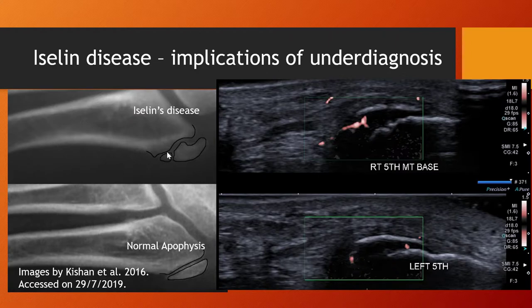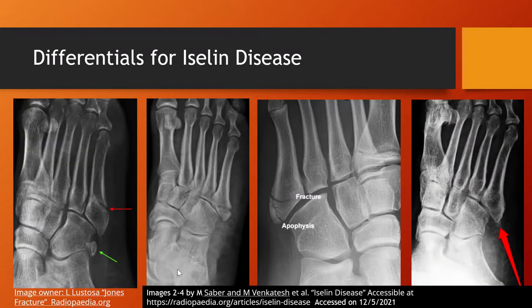And potentially, some of these growth plates don't fuse because of the constant traction and the lack of rest. So of note here, the apophysis is parallel with the shaft of the metatarsal. So the orientation of that bony cartilage gap there is important. So if we go back to our Radiopaedia differentials now, most acute fractures produce a cleft which dissects more perpendicular to the orientation of the metatarsal shaft.